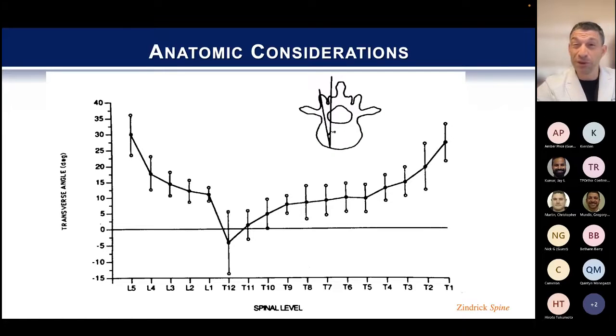Now, you're working through a tube, so there's a lot of flexibility on these angles. In other words, if you think about putting a screw through a tube, you can start at one spot without having to make these dramatic shifts in your medial lateral trajectories, or in how angular you are. For instance, at T12, how often are we really putting in screws from medial to lateral? That's hardly ever happening, right? We're usually going straight in, or maybe even a little bit lateral to medial.